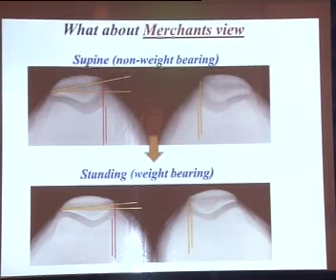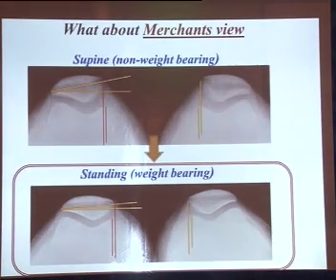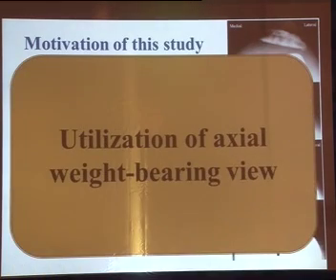So what about a Merchant's view? Is the standard supine non-weight-bearing Merchant's view enough, or is there a need for a standing weight-bearing Merchant's view? The motivation of this study was from the field evaluation of total knee arthroplasty, where there is a validation of a new weight-bearing axial radiographic view, and thus led us to believe that there is a need to evaluate the patellofemoral joint on weight-bearing. Thus, the utilization of the axial weight-bearing view.